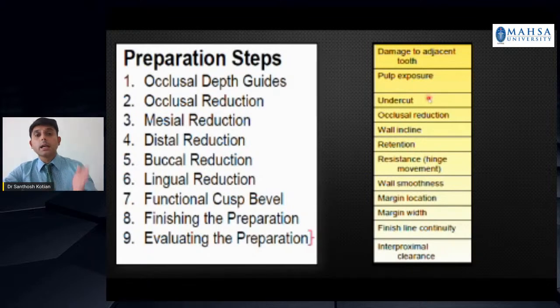Again, how do you analyze? Use the burr to analyze. Always stop, never go on preparing your teeth. Use the burr, place the burr there without rotation, of course. Place the burr and see the gap between the burr and the teeth.